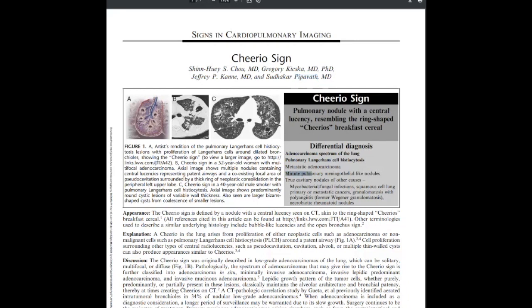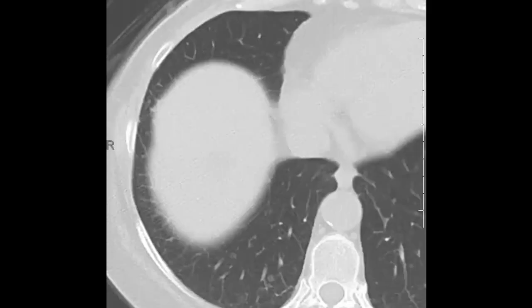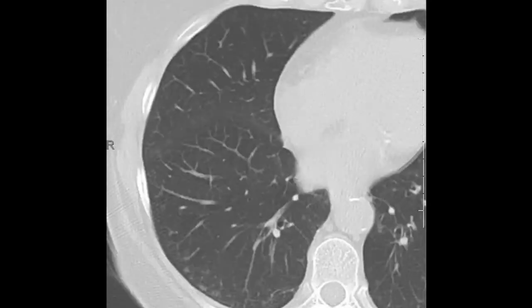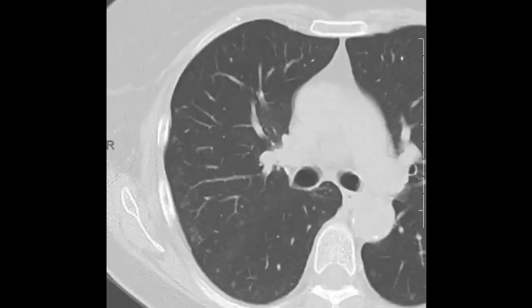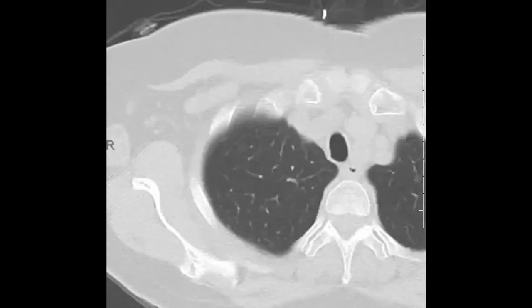Other things to think about include metastatic adenocarcinoma, and then this — meningiothelial-like nodules, or minute pulmonary meningiothelial-like nodules — which is the diagnosis in this case. I've seen maybe seven or eight of these cases live. This just has that look: basal predominant disease with innumerable smudgy nodules, many with a cavitary feel to them.